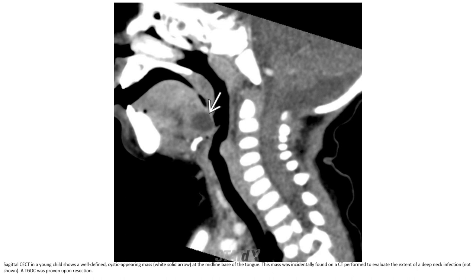This is an axial CT in a young child showing a well-defined cystic-appearing mass at the midline base of the tongue. This mass was incidentally found on CT performed to evaluate the extent of deep neck infection. The thyroglossal duct cyst was confirmed on surgical resection.